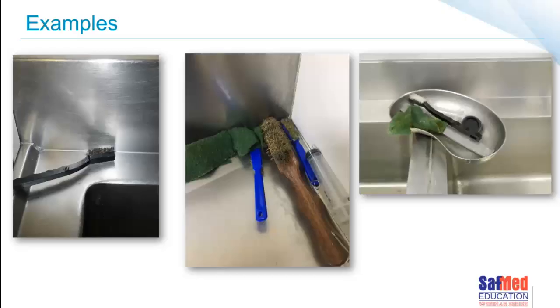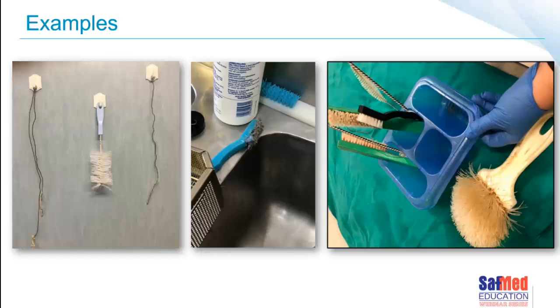And the horrendous scourer. Please, we do not want to be using scourers. They are abrasive, and they also catch debris. You're going to have all sorts of debris sitting in there, and they're quite hard to get clean again. So debris lying caught in that actual scourer. I know that we have certain things that are difficult to clean, but really these are not the ideal tools to use.